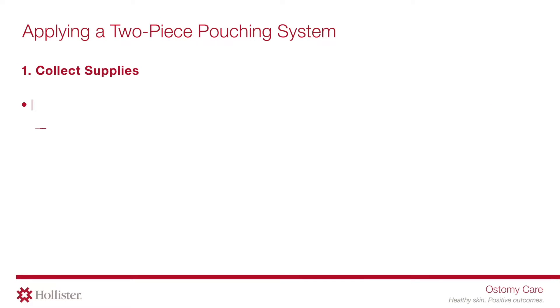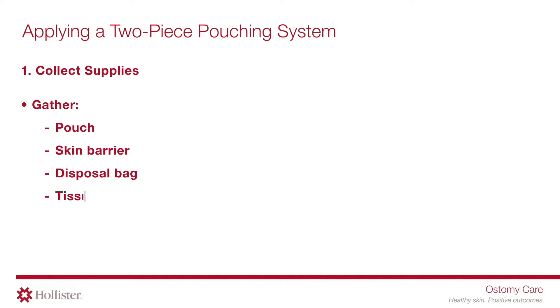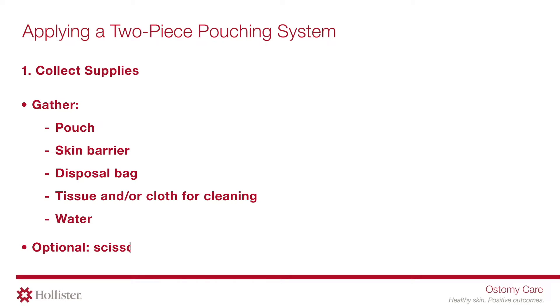Collect supplies. Gather pouch, skin barrier, disposal bag, tissue and/or cloth for cleaning, and water. Optional: scissors, pen, measuring guide, and/or accessories.